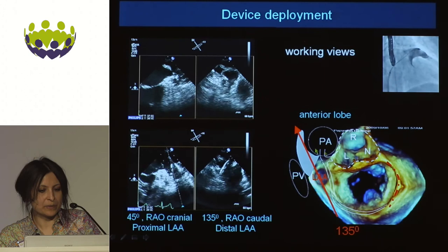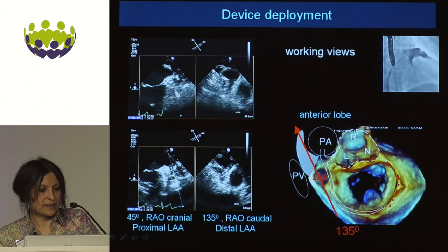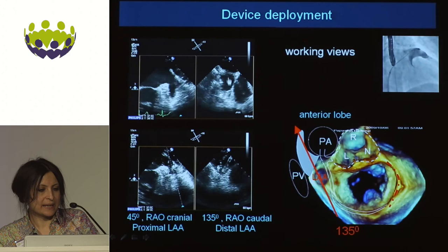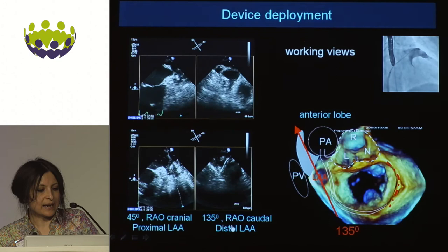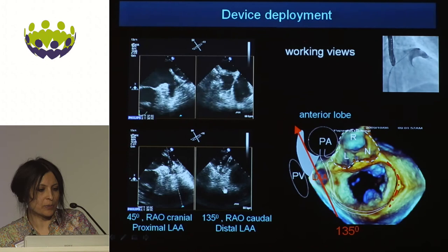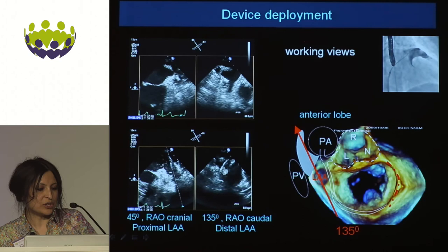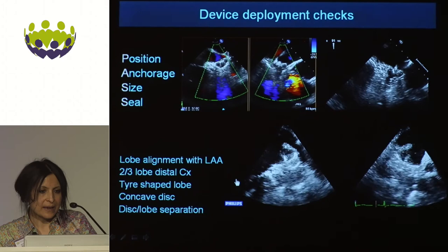During deployment, remember that the longer lobe tends to sit anteriorly — that's the 135 view. The 45-degree view gives you the proximal part of the appendage, equivalent to the RAO cranial view. The 135 view gives you the length and the most anterior part — the longest lobe usually — equivalent to the RAO caudal view. It's useful to work simultaneously in these views so the operator can see the sheath coming in and assess the angle. When we started, the sheath was pointing the wrong way, and the operator was able to reposition to access the anterior and longest lobe. These two views are essential during the procedure itself.